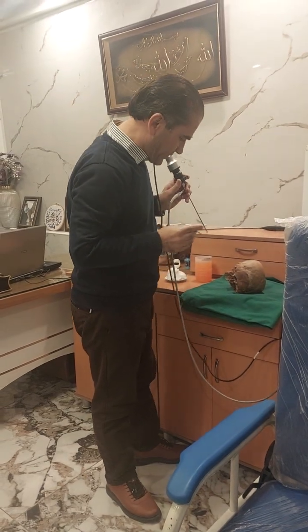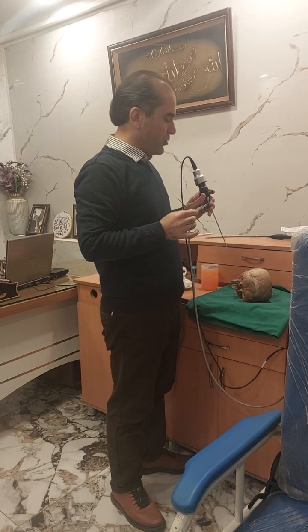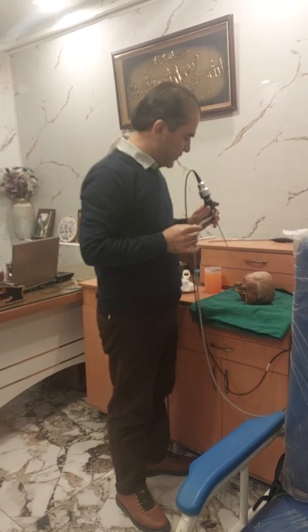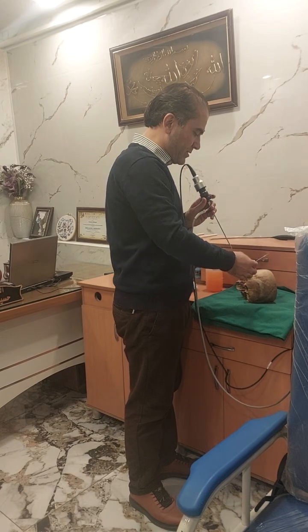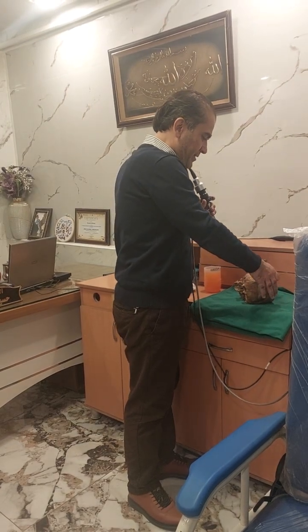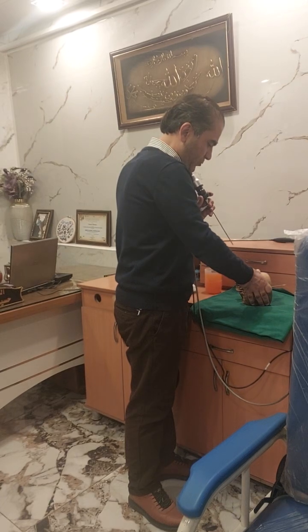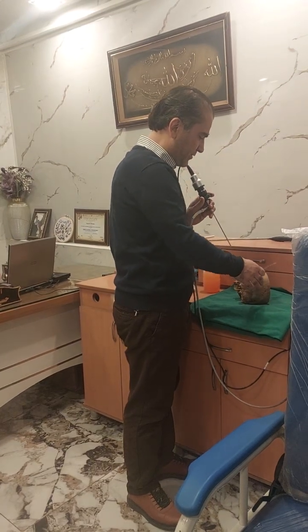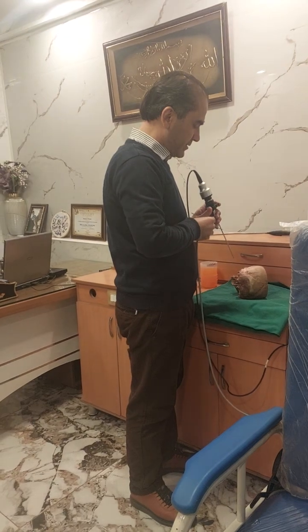Now I will demonstrate the endoscopic view of the temporal bone, the anatomic landmarks. So we have now this bone, the normal bone of the human. This is not an artificial one. This is the normal anatomy.